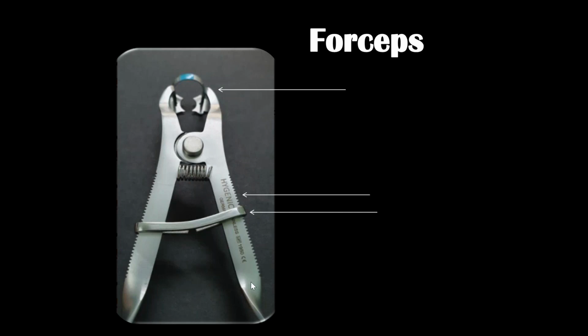And then you have other additional factors, like for example, the handle. The handle has serrations. So these serrations act like a lock mechanism. This is a ring slide. This is a sliding ring. So the moment you press the handle, the sliding ring, which was originally here, will slide down. So at this point, there'll be a stop and you will think, okay, the clamp will not widen beyond this. Actually, you can widen it beyond this, but it's just the stop which has been created by this, which is preventing any further widening. So what you have to do is that you have to push this back and press the handle further for further widening.